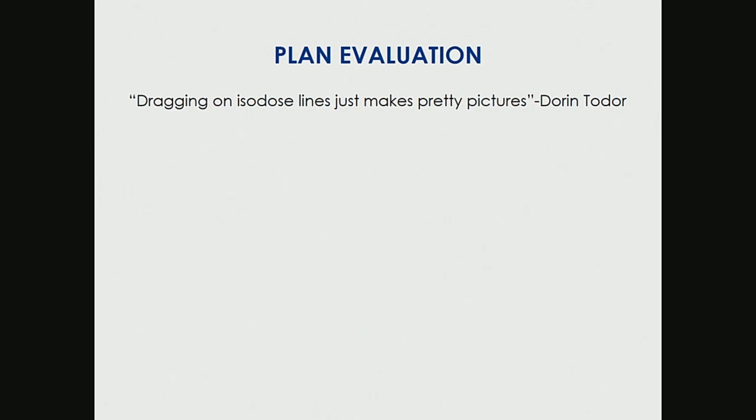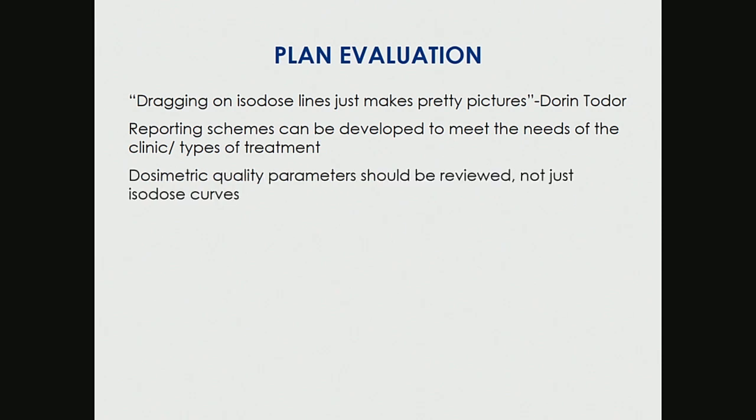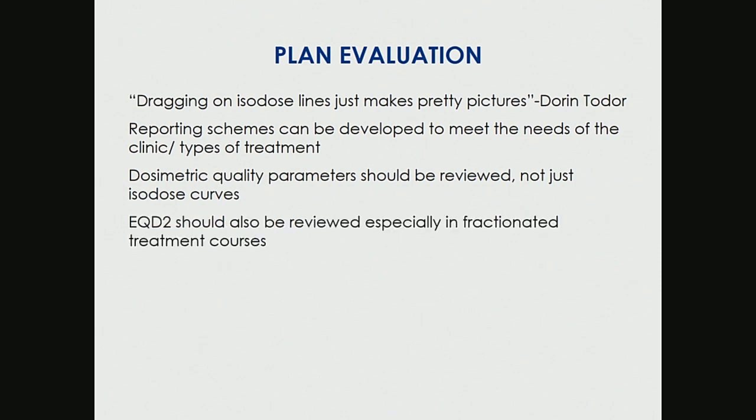Certainly you should evaluate the isodose coverage of your treatment, but just dragging on the isodose lines to change your coverage might not be the best way to evaluate your plan. Each clinic and each treatment type should develop its own reporting schemes. So you can review dosimetric quality parameters, not just isodose curves.